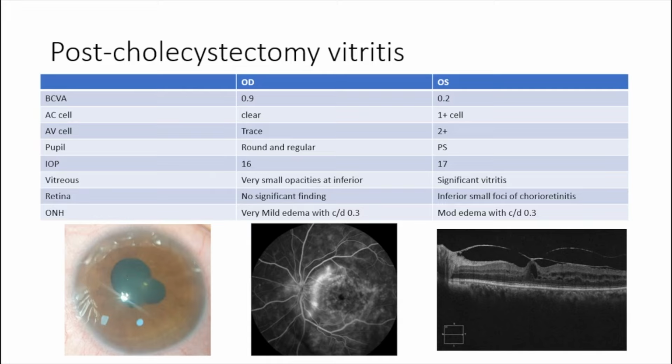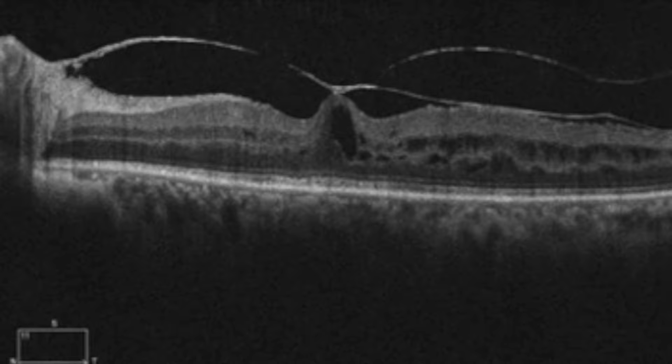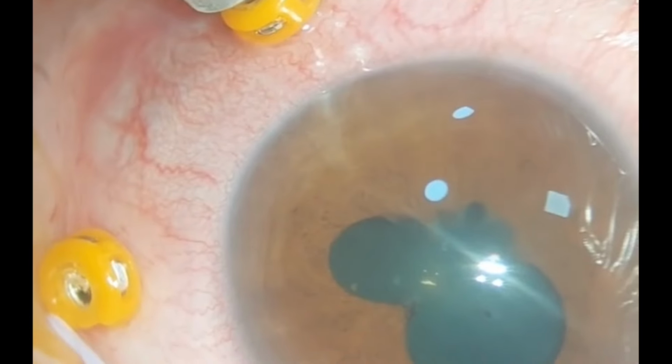2 months after cholecystectomy. Given the high clinical suspicion, imaging evidence of persistent posterior hyaloid adhesion, and the risk of future membrane formation, the patient was scheduled for pars plana vitrectomy with diagnostic sampling.